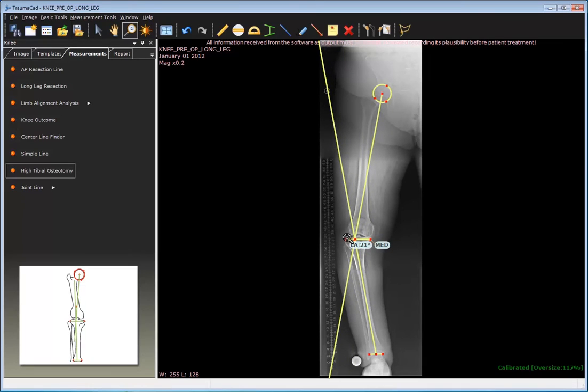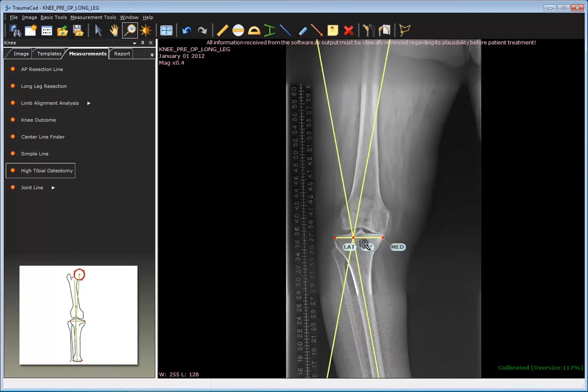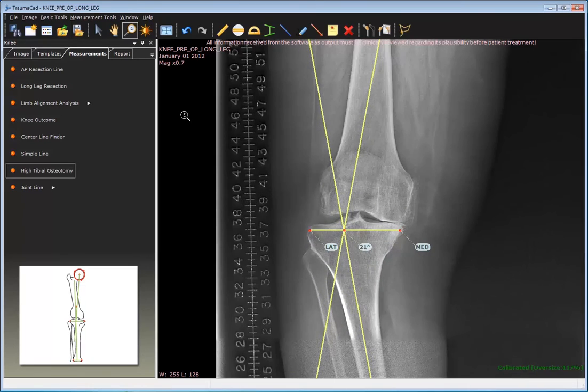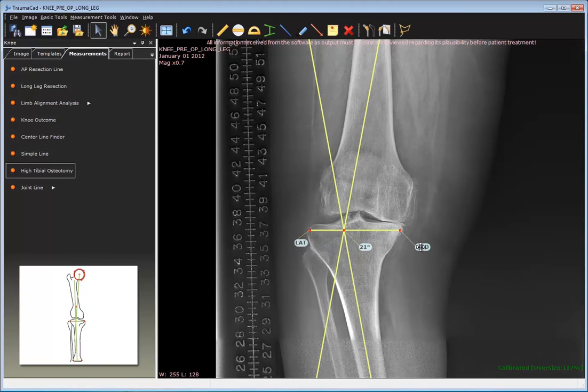The red dot is calculated to represent the point that is 62% of the distance from the medial to lateral towards the lateral side.